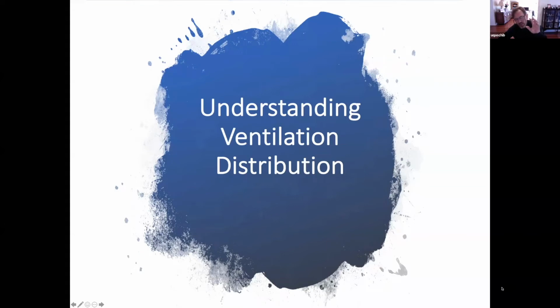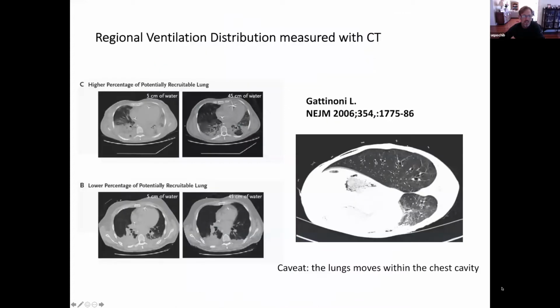So I'm going a little bit outside the topic of EIT first, because it's very important to understand what ventilation distribution actually is. I've done years of inert gas washout research, and that's where my passion for ventilation distribution and EIT research came from. If we look at ventilation distribution, the easiest way in the end is doing some imaging and seeing where collapsed lung is and how we can recruit lungs. If you're using imaging techniques, this is a very important part of it.